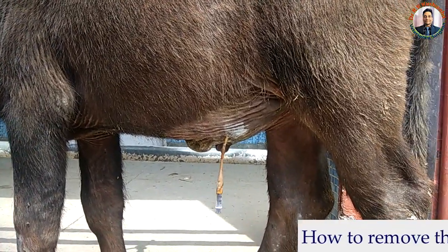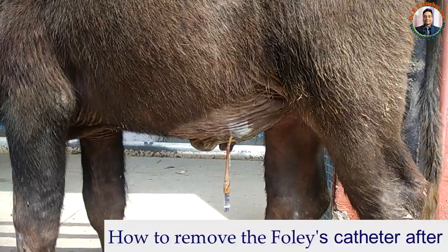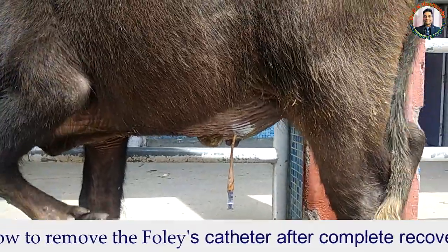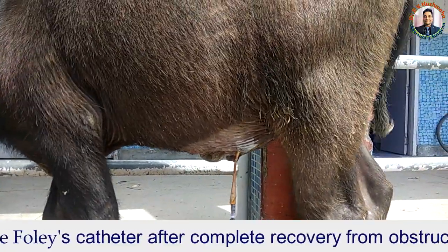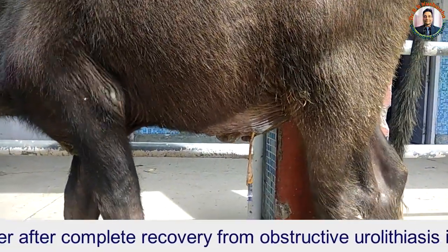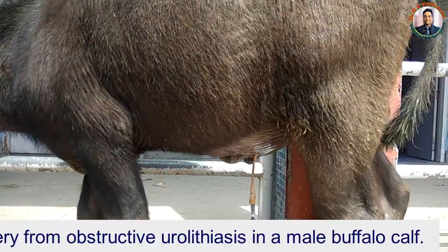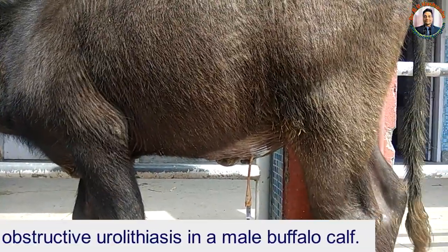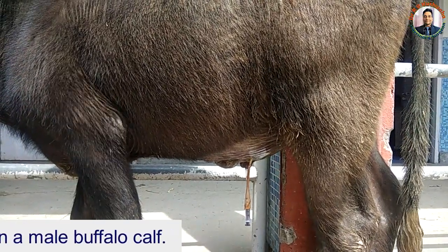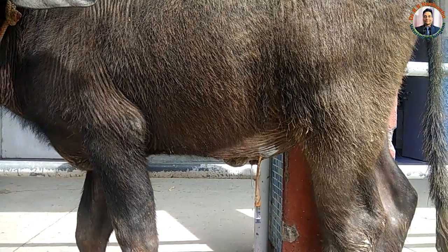We performed tube cystotomy in this calf more than one month back for the relief of obstructive urolithiasis. I have already uploaded a few videos on how to perform the tube cystotomy, so you can see those videos on my YouTube channel.